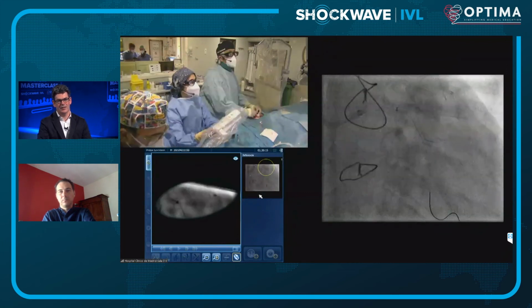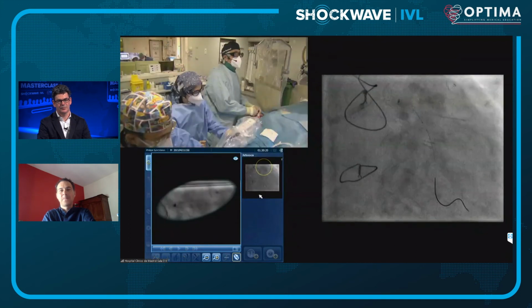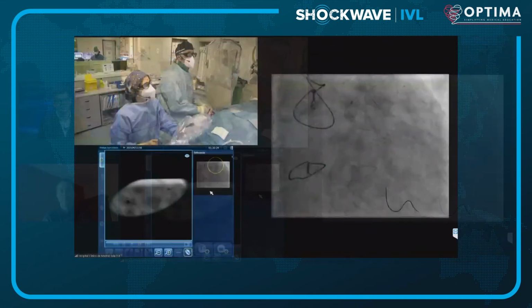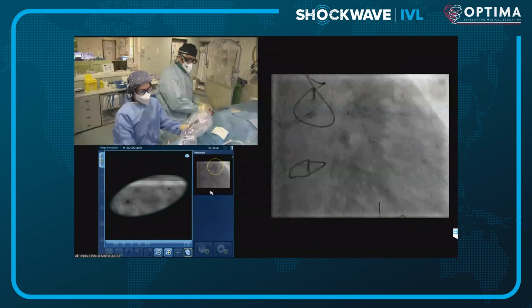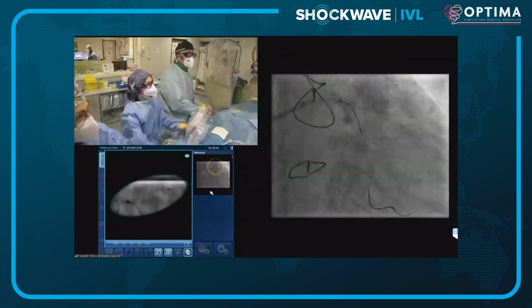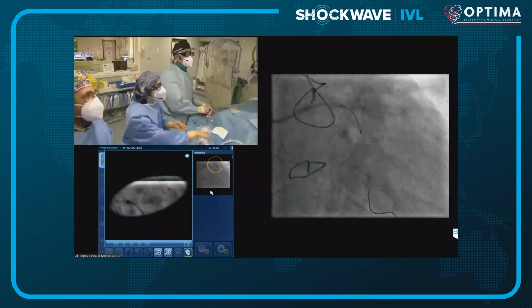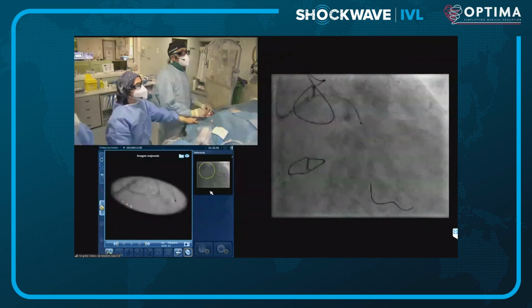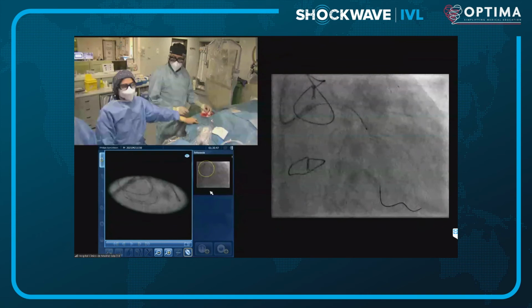I can tell you that the navigation of this guiding catheter extension has been phenomenal. So that means that we have a beautiful lumen over there. Yes. And you can now deliver the OCT through. Now, of course, what I will do is I will retire it because I don't want to make a selective injection. I will put it away, something like 40 centimeters, so it is not displaced by the power injector. Good.